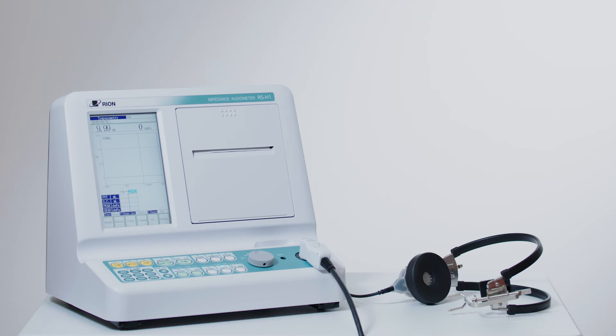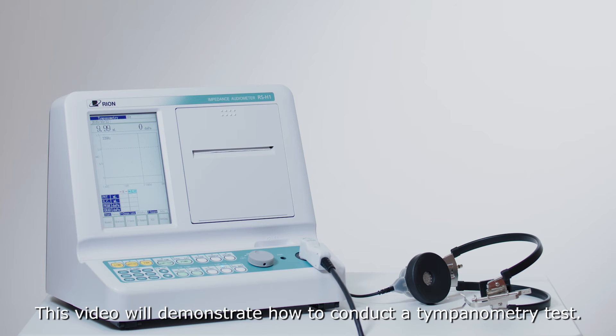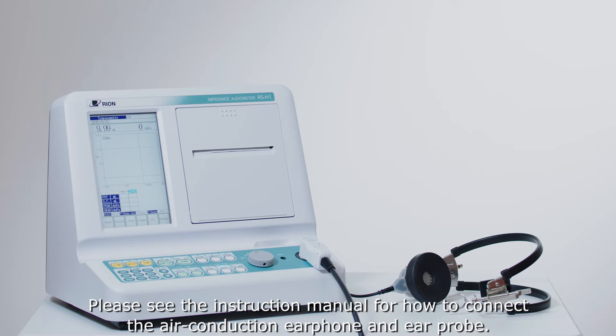The information in this video is intended for medical professionals. This video will demonstrate how to conduct a tympanometry test. Please see the instruction manual for how to connect the air conduction earphone and ear probe.